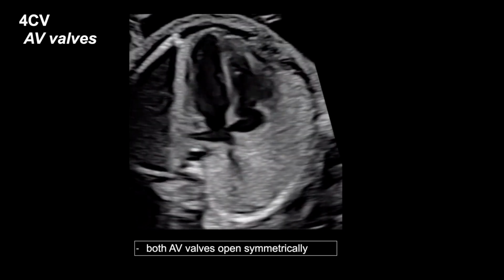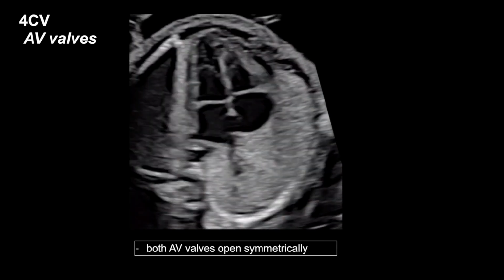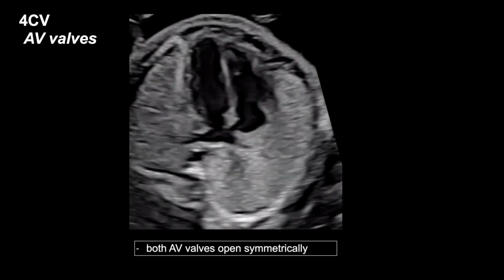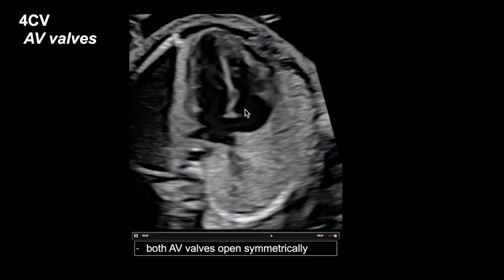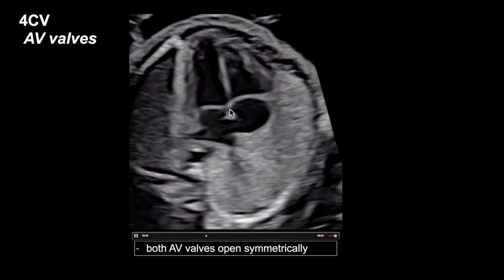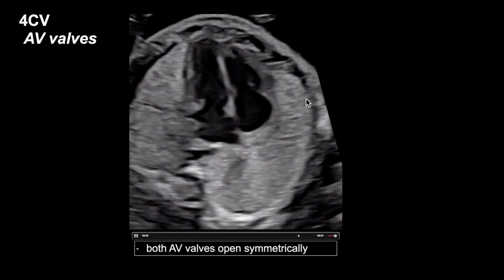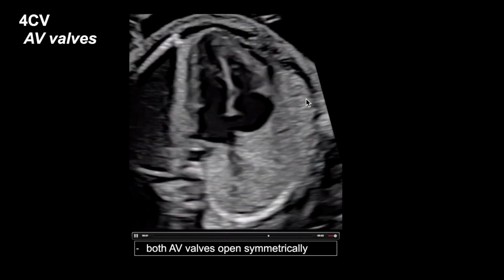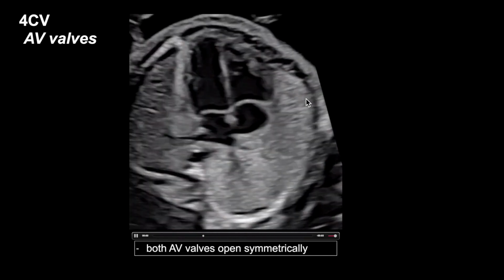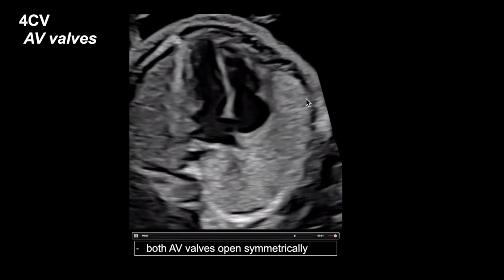Once I've finished looking at the global overall picture of the heart, I've noted the position, axis, and size all look fine. I've noted that the tricuspid valve looks like it's slightly more apically offset than the mitral valve, and I can see a moderator band in my right-sided ventricle. The proportions all look pretty equal, and basically, in my mind, right is right and left is left in terms of morphology of the ventricles.